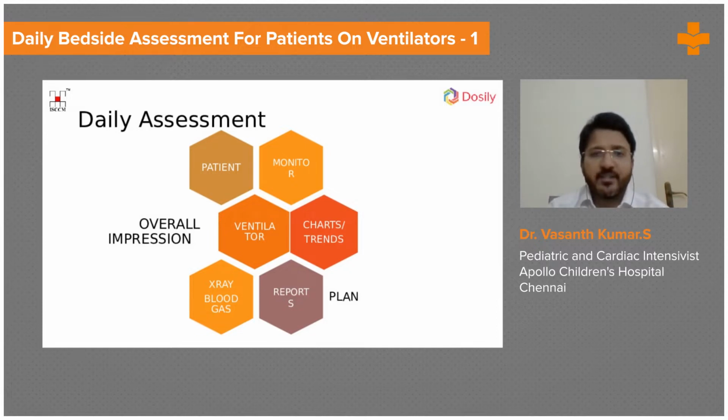Suppose you see a ventilated patient in your ICU. So what all will you do in your daily assessment? First you will have a look at the patient. Then you will check the monitor. Then you will see the ventilator. Then you look at your chart.